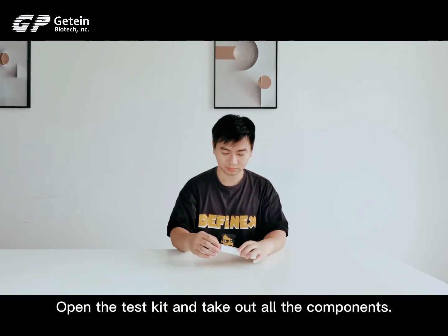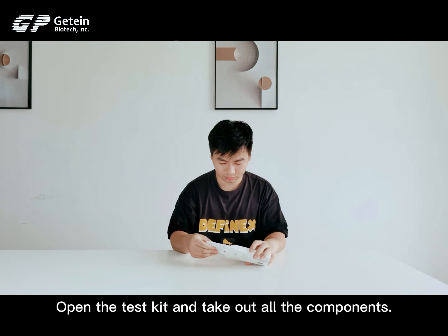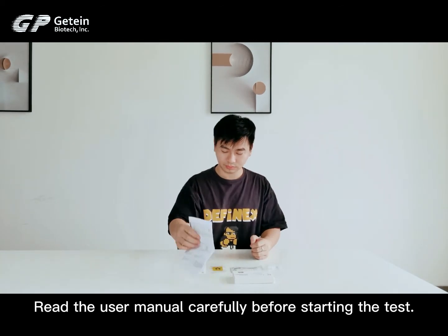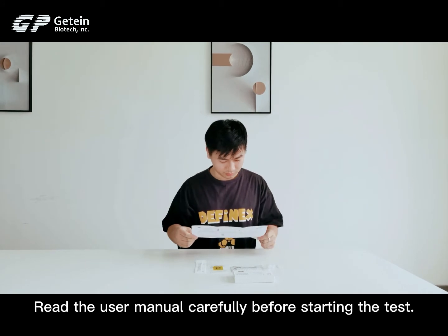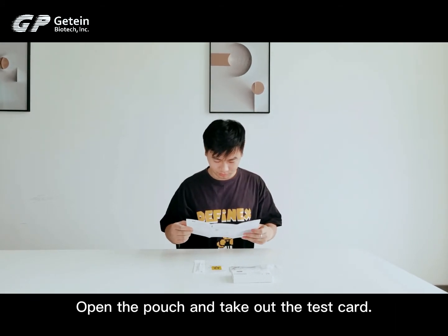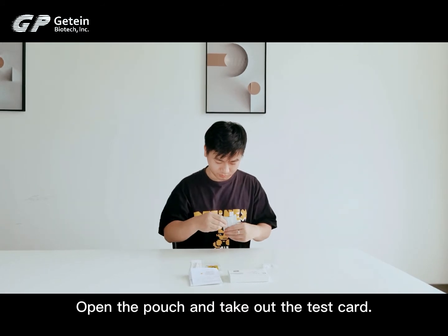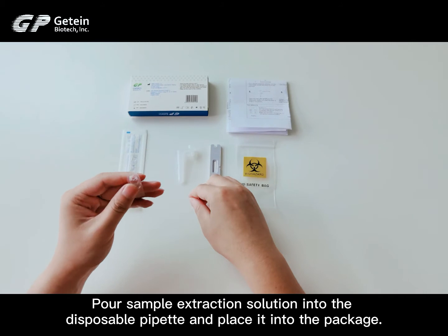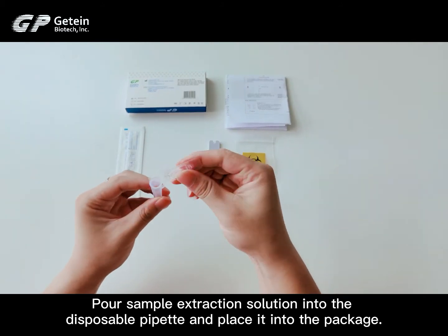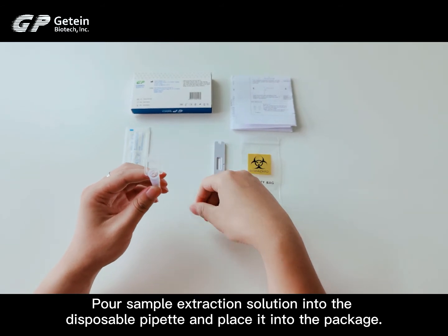Open the test kit and take out all the components. Read the user manual carefully before starting the test. Open the pouch and take out the test card. Pour sample extraction solution into the disposable pipette and place it into the package.